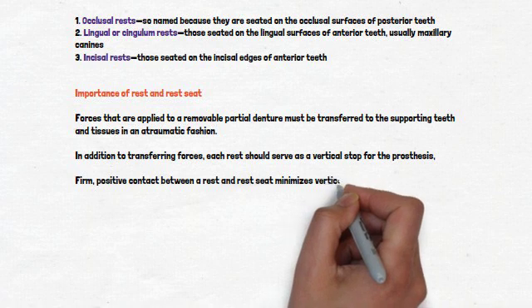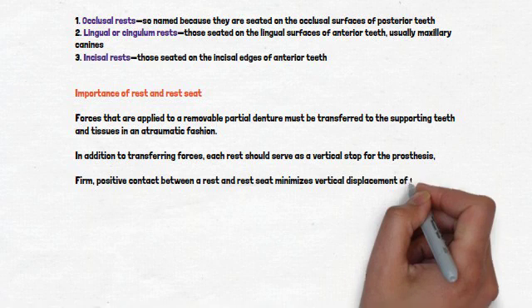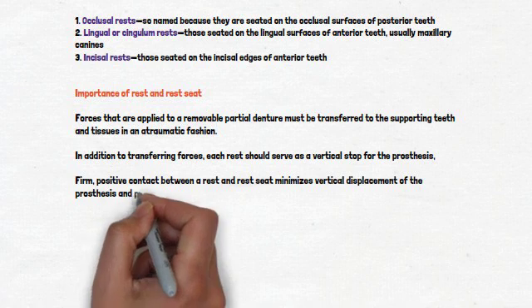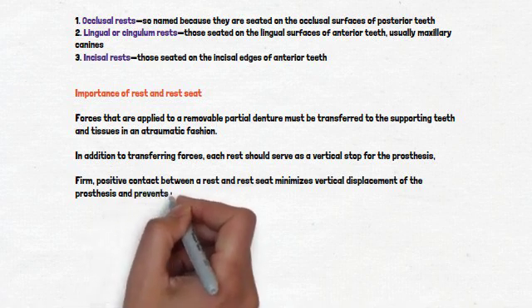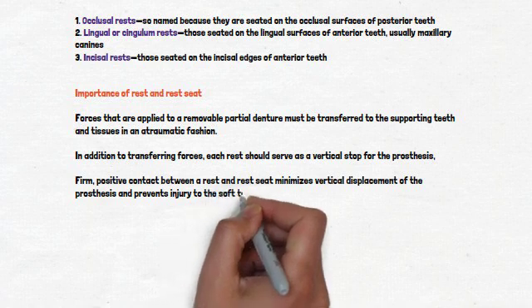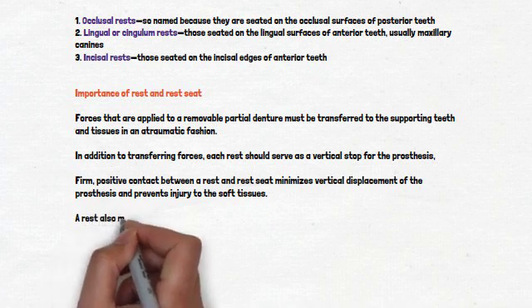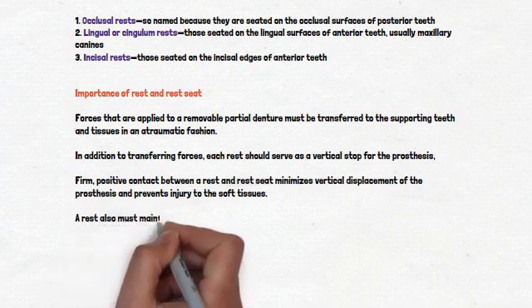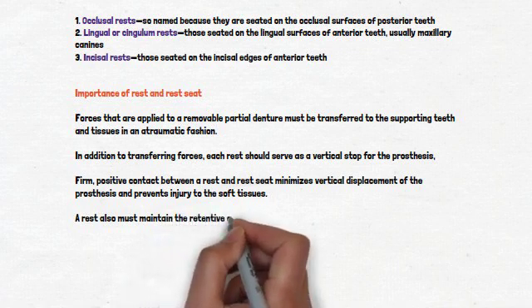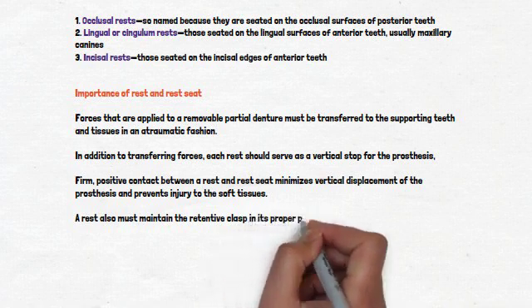1. A lingual rest is preferable to an incisal rest because it is placed closer to the horizontal axis of rotation, the tipping axis, of the abutment and therefore will have less of a tendency to tip the tooth. In addition, lingual rests are more aesthetically acceptable than are incisal rests. 2. A slightly rounded V is prepared on the lingual surface at the junction of the gingival and the middle one-third of the tooth. 3. Sharp line angles and corners must be avoided because they complicate the fit of the cast framework and may serve as stress concentrators.